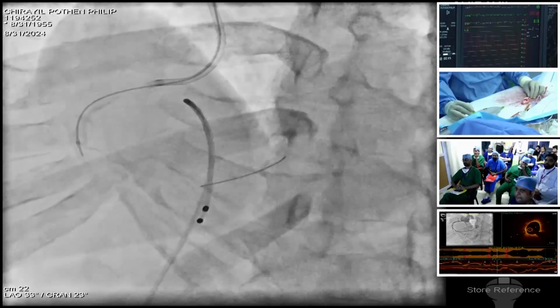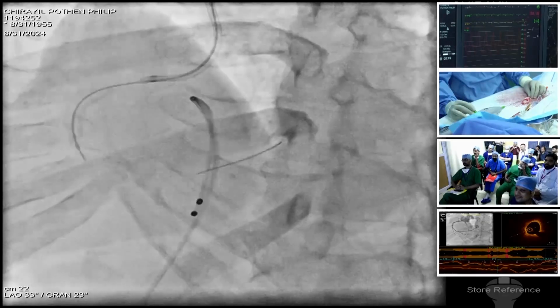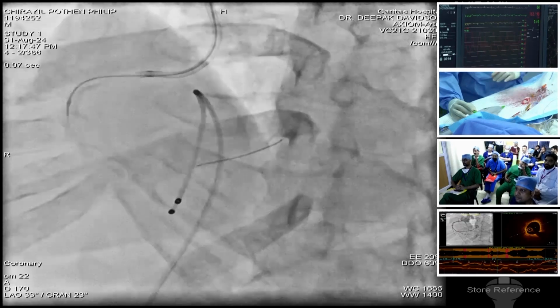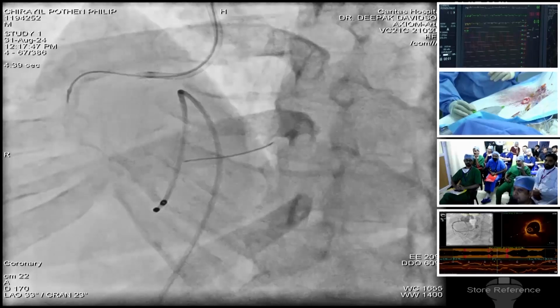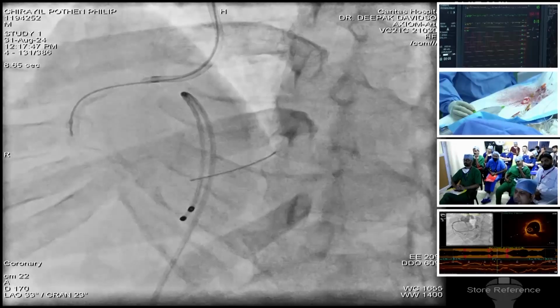Yeah, we are hearing the sound here. You can appreciate the damping. Now we'll do retrograde also, at 120. At the endpoint of ablation, we usually see this pitch change. These are the two things, Vishnu.